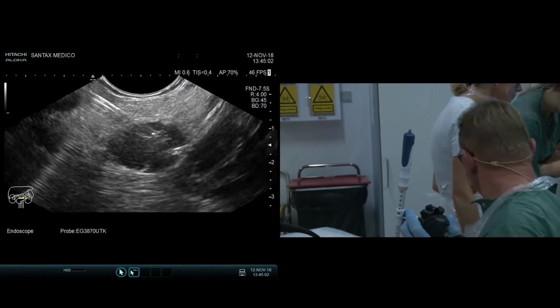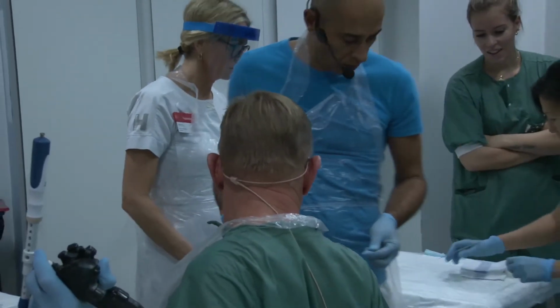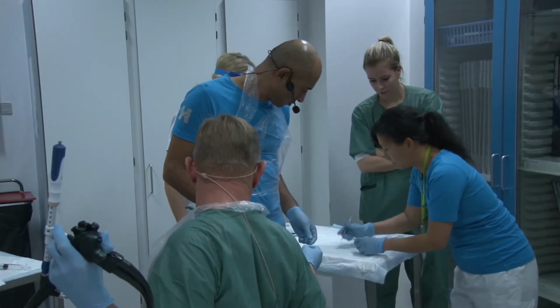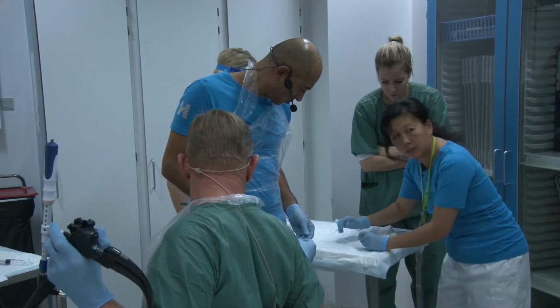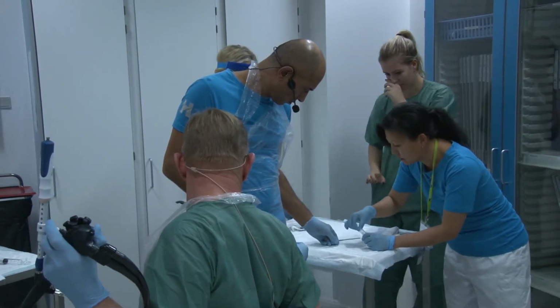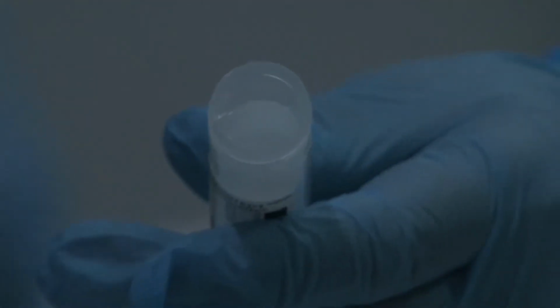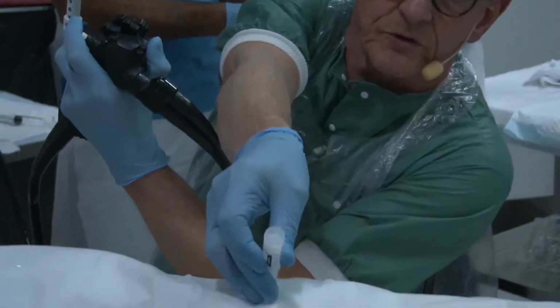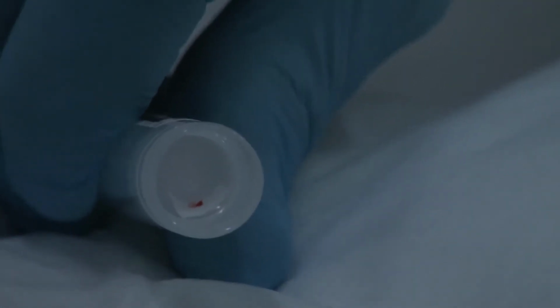Okay. So it's very nice. Is it possible to see from the camera? Only if you have it. It's on the thing. Yeah, it's possible. Is it possible to see this? Let me see whether I can see it. Yeah, you can see it. I think you can see it if you focus on that. Can you see it? Yeah, that's okay. Perfect. Okay.